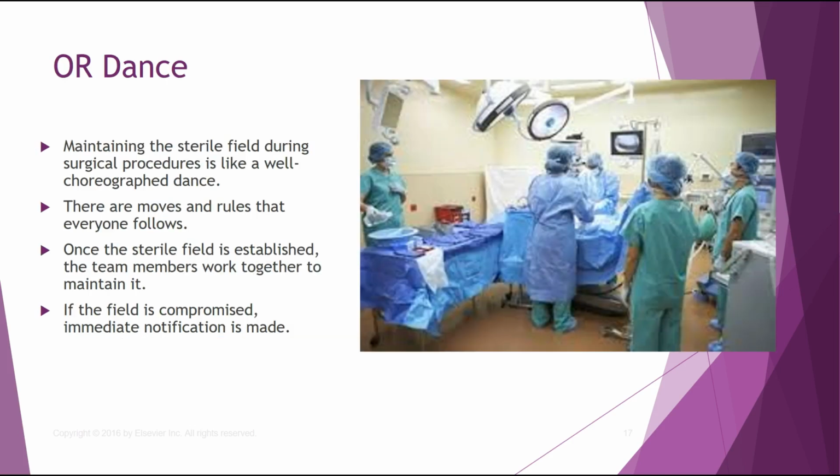Okay, the OR dance. They're talking about how everybody works together. You don't want to contaminate the sterile field. You don't want to bump into each other. You need to know what everybody's doing and anticipate each other's needs. Most importantly, as a radiographer, you are going to stay out of the way until you are called to do your duty, your job. Once you do that, you're out of there.